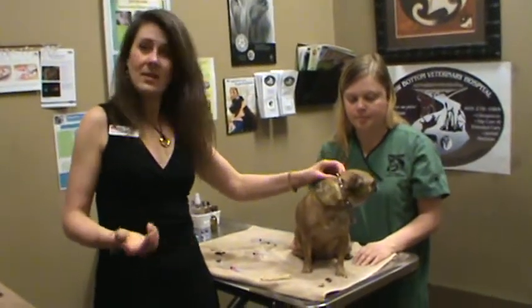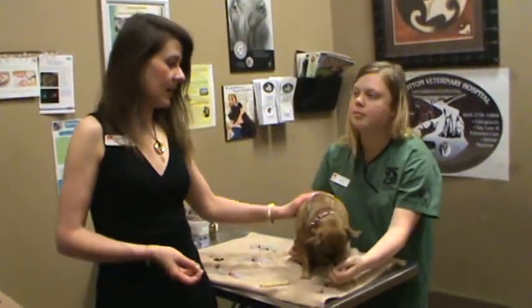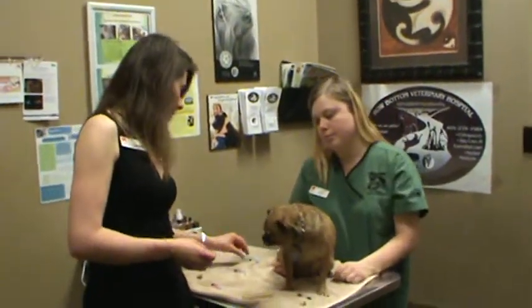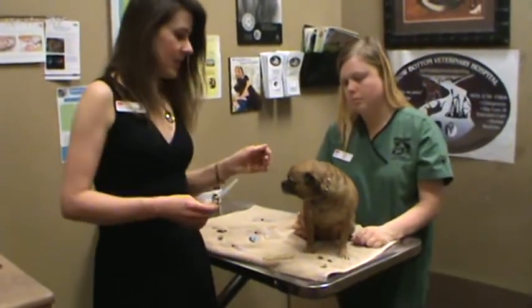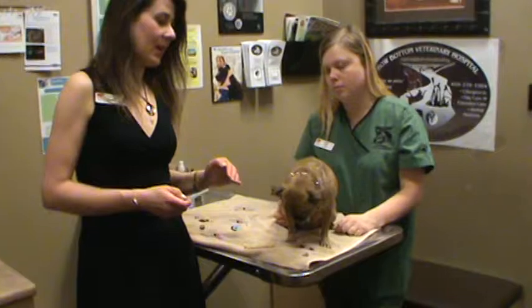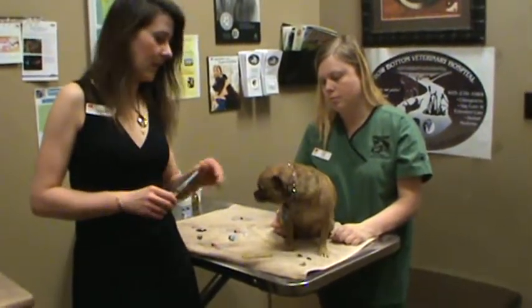Some animals need insulin injections every day, twice a day. So it's very important to get an understanding of what's going on. It's important to be as sterile as possible, and today I'm going to give a vaccination injection, but giving a subcutaneous Cartrophen injection or insulin injection is very much the same.